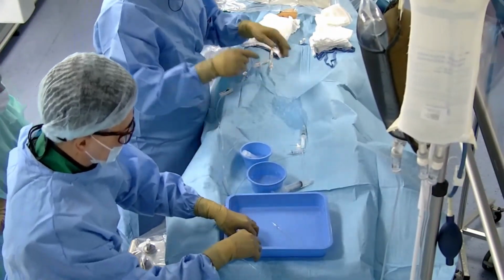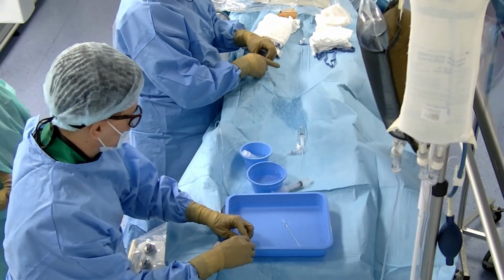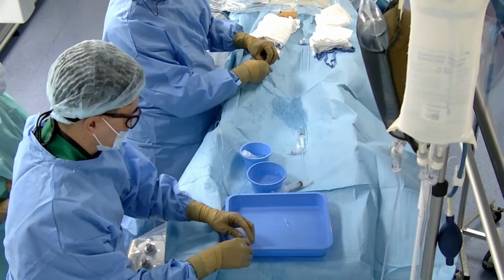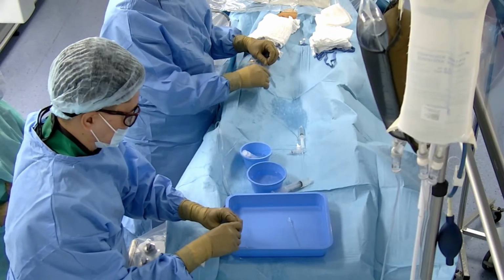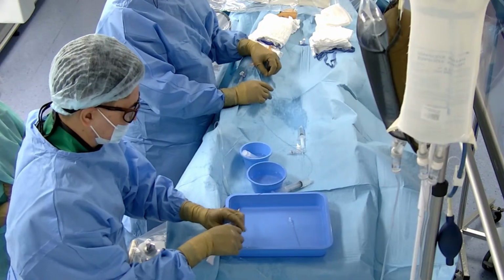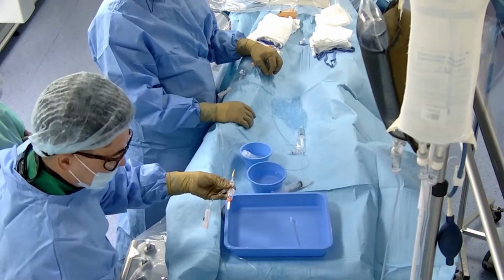Okay. And for this aneurysm, concerning the size of the ICA, it is nearly 5. I think the better decision will be to place a LEO Plus and put 1 or 2 coils inside the aneurysm.